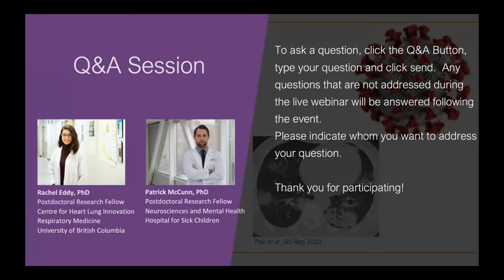Yeah, if I might add to that, Tanya, sure. Within the user interface of the Aspect, we have those standard protocols in there. But even as a novice user, there's some options. You want to be able to adjust your echo times and your repetition times and things like that to adjust your contrast slightly. And those are definitely available even to someone without, you don't need to do the pulse programming or anything like that. The user interface allows those sorts of things. So you can adjust a lot of these to suit your needs when it comes to these pulse sequences.